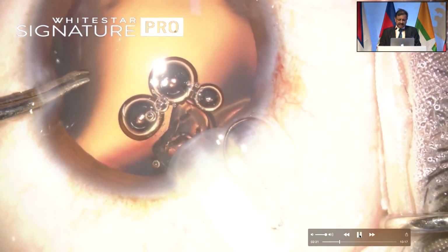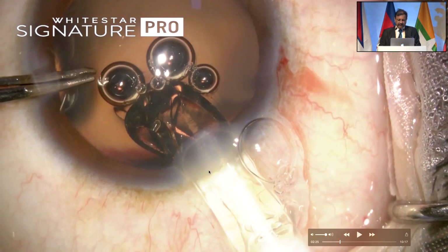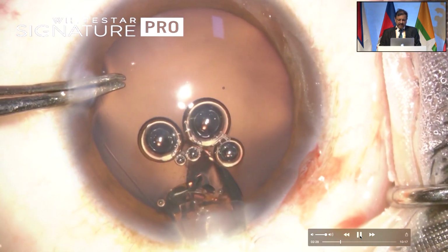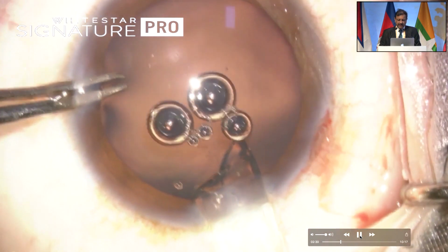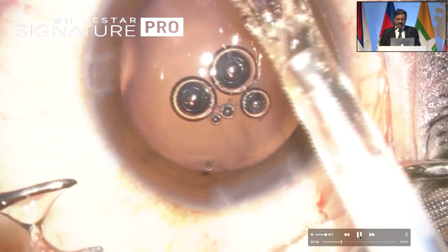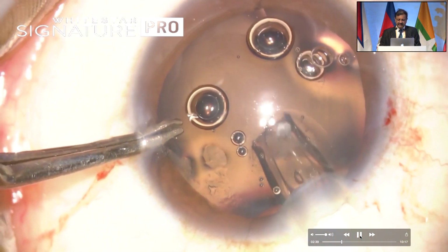Sometimes the edge can get stuck inside the wound. If you observe carefully, I was trying to forcefully push and the leading part is stuck onto the wound. So now watch how the lens will unfold. You actually need to withdraw, reload, and don't try to push the lens inside because the lens can get torn off or you can have an upside down lens.